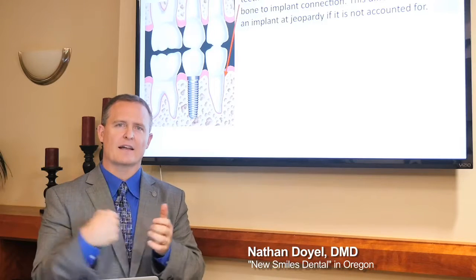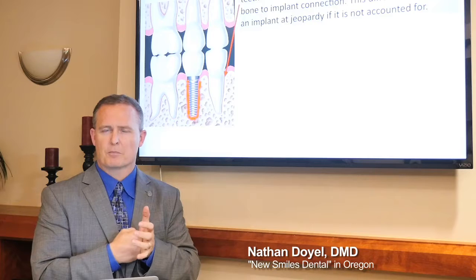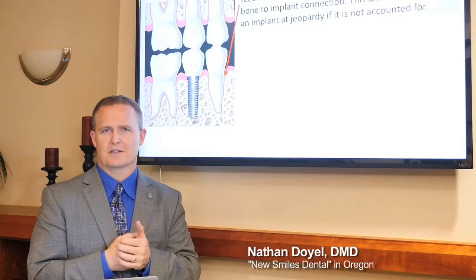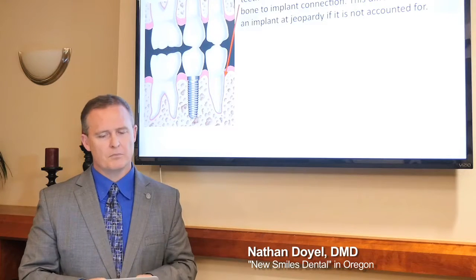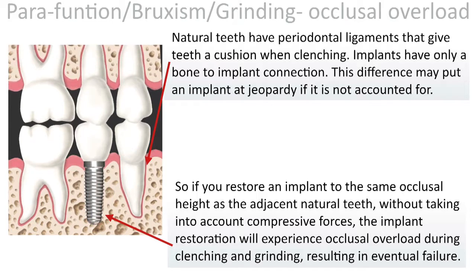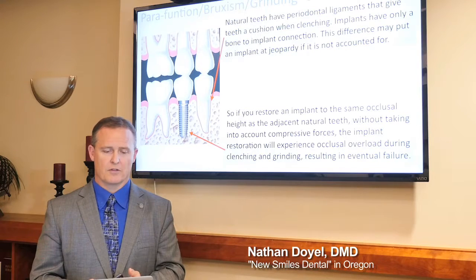They're now able to contact that implant that you thought was out of occlusion, because you didn't have them pressing under high stress or high tension. So that tooth is actually coming in contact. Be sure you test them under high compression, biting down firmly, to make sure the implant isn't being touched while it's in the healing process. And even when you finally have a final restoration there, you don't want that tooth to be under compression and hitting hard when they're biting down firmly and the adjacent teeth are able to hit and load the ligaments.